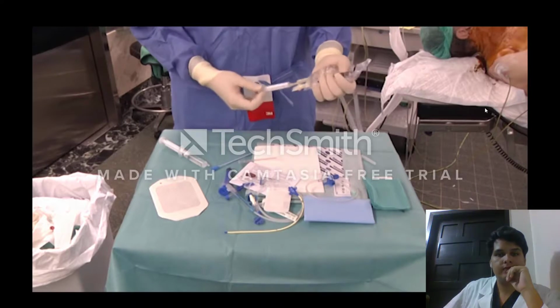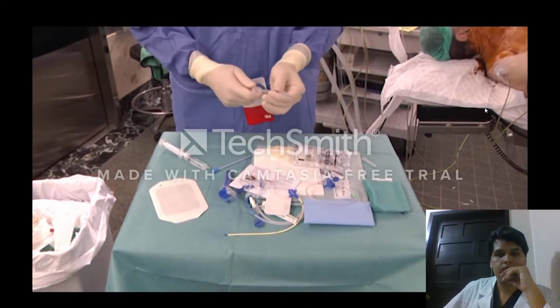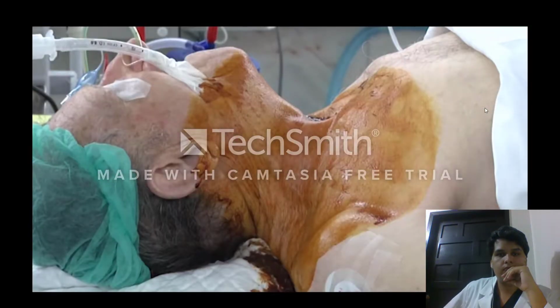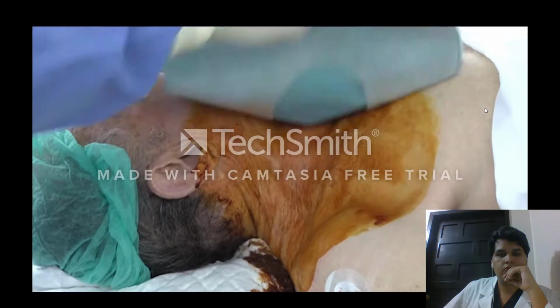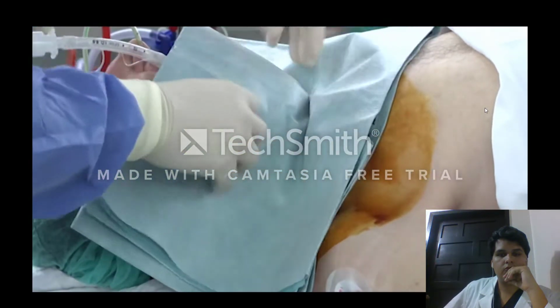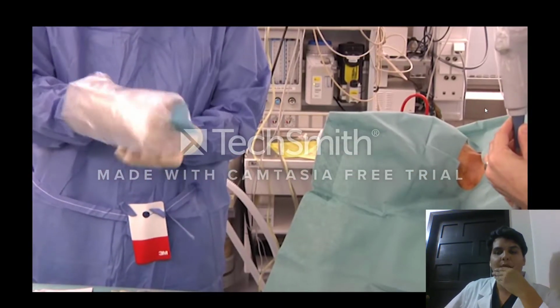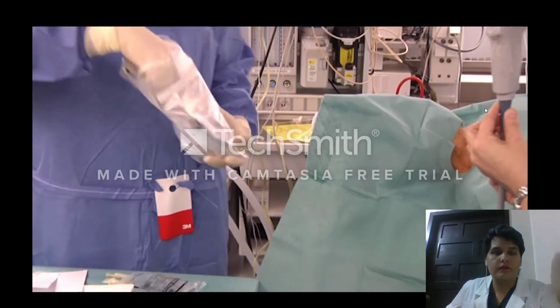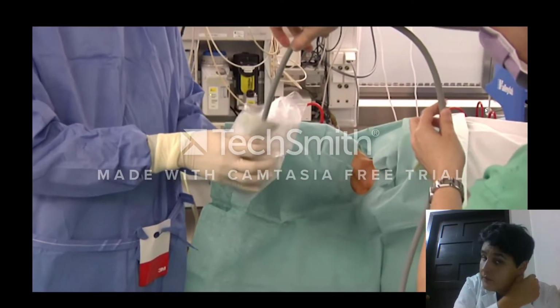The cannulator prepares the material and surgical field using an aseptic technique. The ultrasound transducer is then covered using a sterile sheath to avoid contaminating the surgical field.